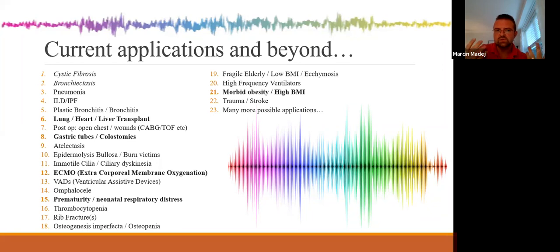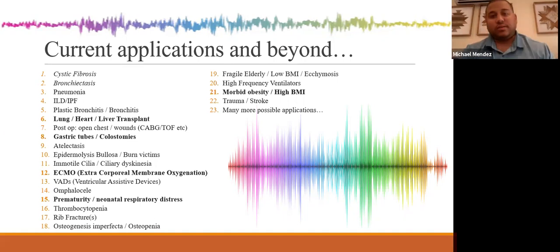But this was a slide I wanted you to look at to see what other conditions I have used the frequencer with. And Mike, do you have any particular additions to this slide? Well, yes. When using the frequencer in general and setting it up for ventilator patients or non-vented patients, it's really simple. You have different intensities starting from your newborns, infants, preemies, up to your pediatrics and adults, going from less intensity to higher intensity. And then you have your frequency range, which is usually between 37 and 42, but for secretions in human airways, around 40 hertz is what we're going to use.